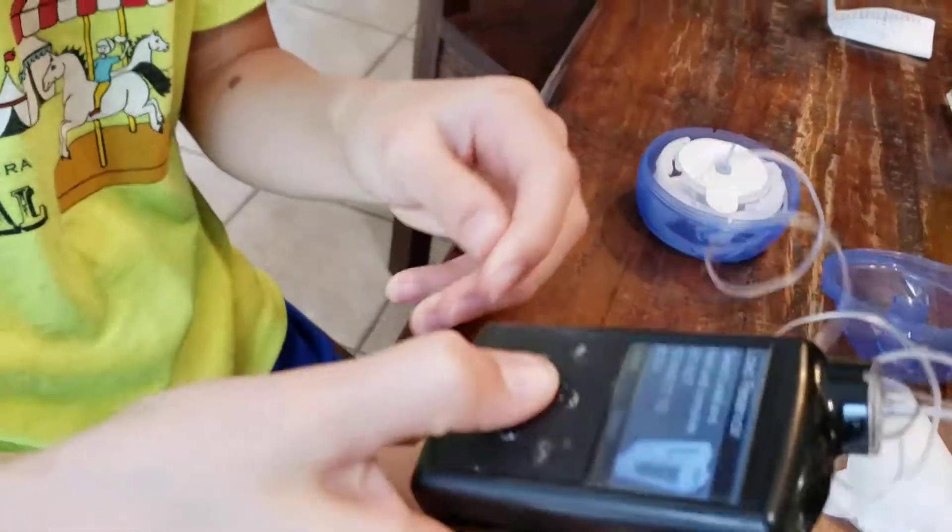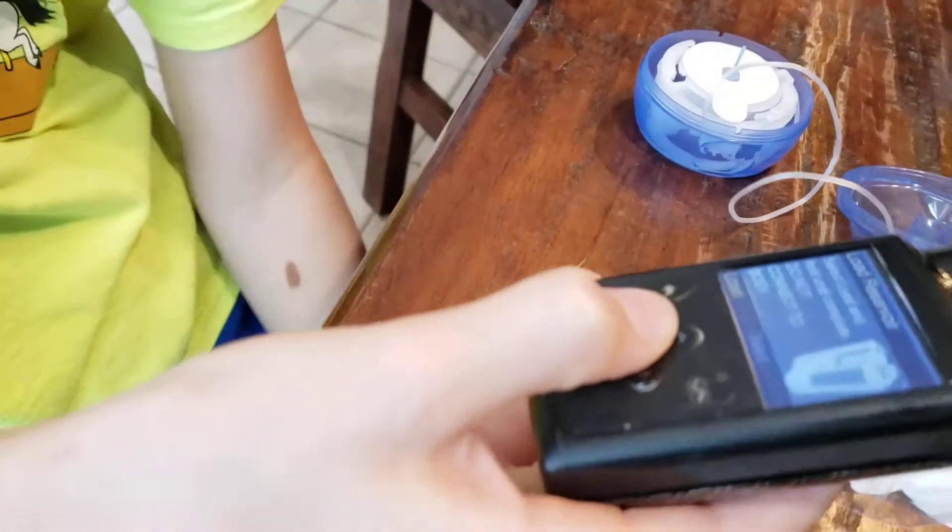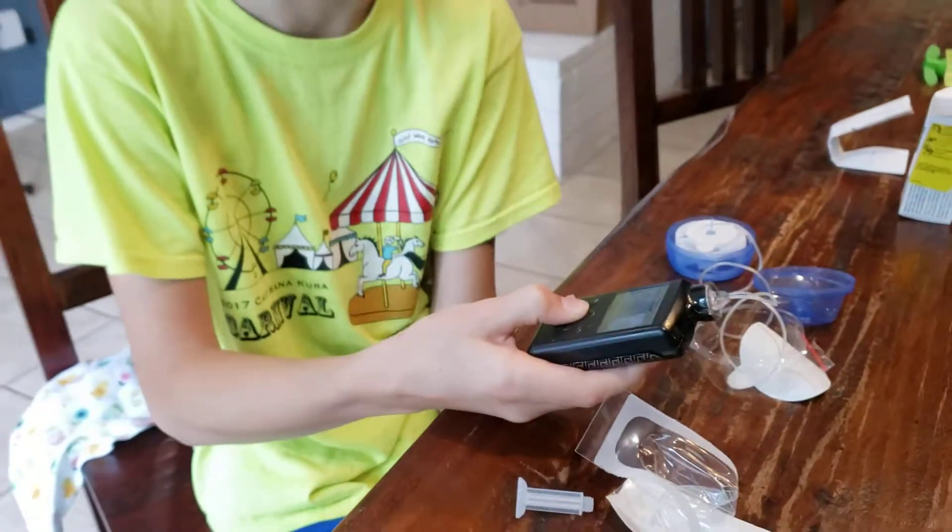So now you have to select load. You have to hold it down, and I recommend using the thumb.